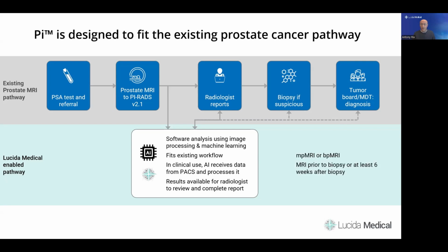PI is able to support MPMRI with contrast or BPMRI, biparametric MRI, without contrast, as long as images are PI-RADS compliant and of diagnostic quality. PI is particularly relevant for pre-biopsy MRI so that it can support decisions about whether to biopsy and what lesions to target, but it can also be used with post-biopsy MRIs that are performed at least 6 weeks after a biopsy.